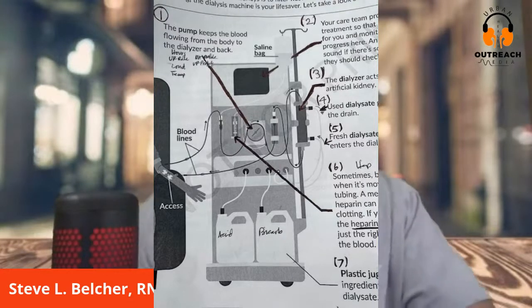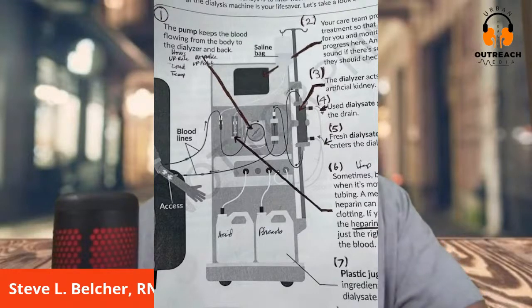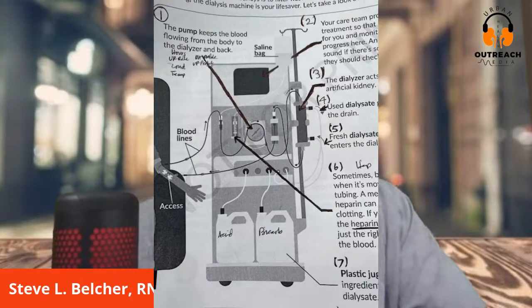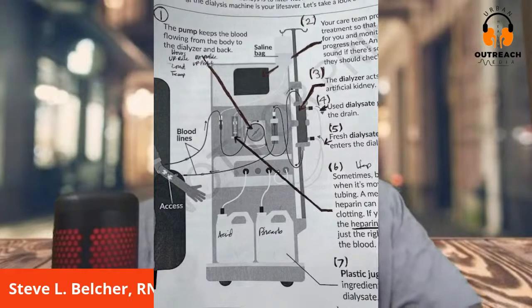Let's start with number one at the top left, the pump. That's the blood pump. Usually it's centered right in the middle, and it's a spinning wheel. You'll see it rotating around. The pump keeps the blood flowing from the body to the dialyzer and back.